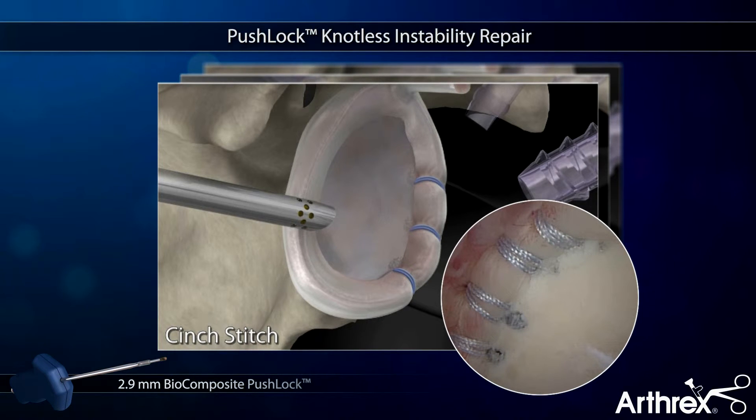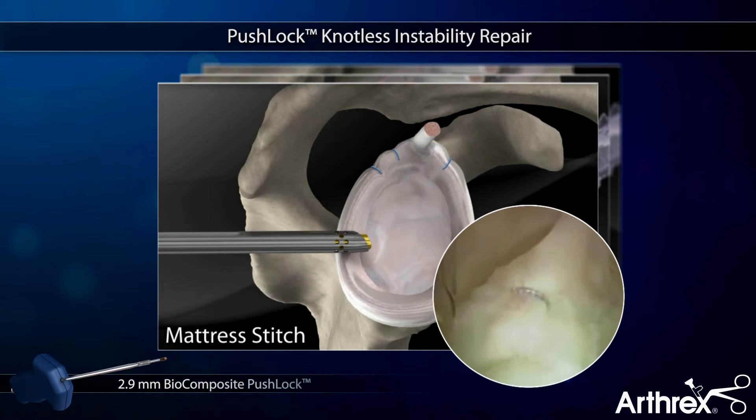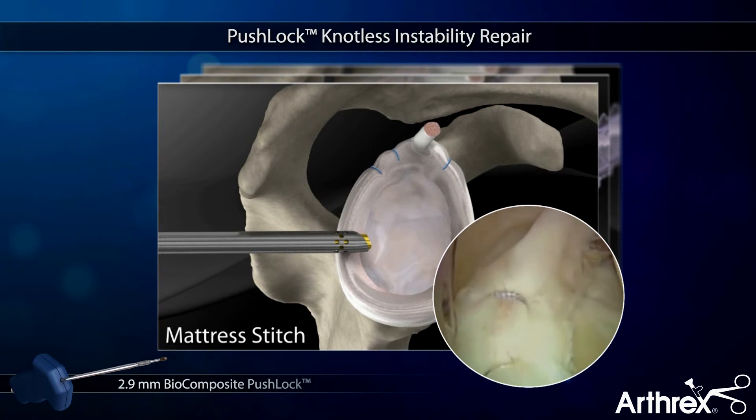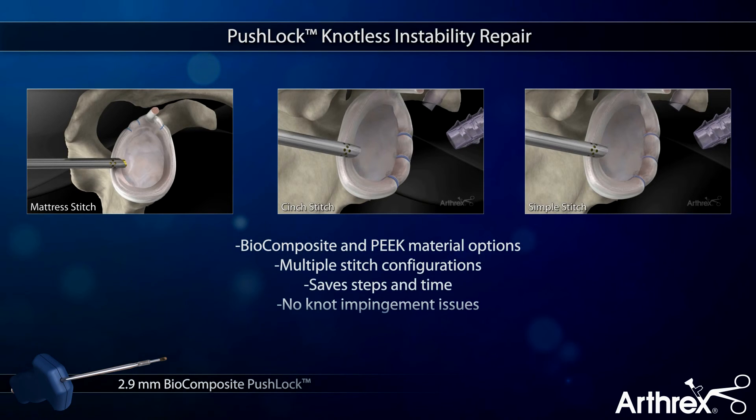The suture-first technique also allows the freedom for multiple stitch configurations, like cinch stitch and mattress stitches. The knotless Push-Lock saves steps and valuable time while providing a secure repair that eliminates issues with knot impingement.